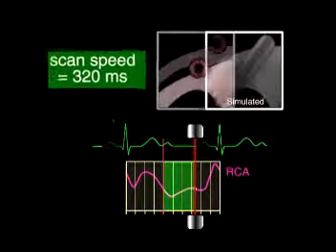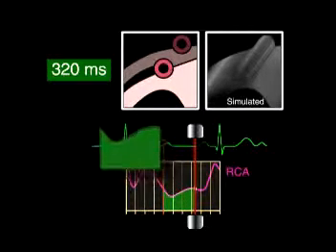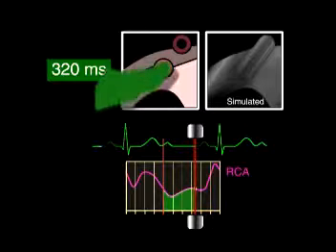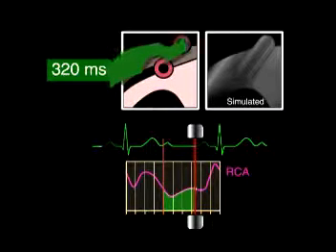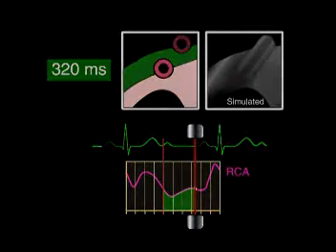The diagram shows the displacement or distance traveled over the image acquisition period. Note that the area beneath the RCA velocity curve, highlighted in green, represents the duration of the acquisition multiplied by the velocity that the artery was moving at each point during the acquisition. This area is therefore symbolic of the total amount of motion or blurring present in the image.